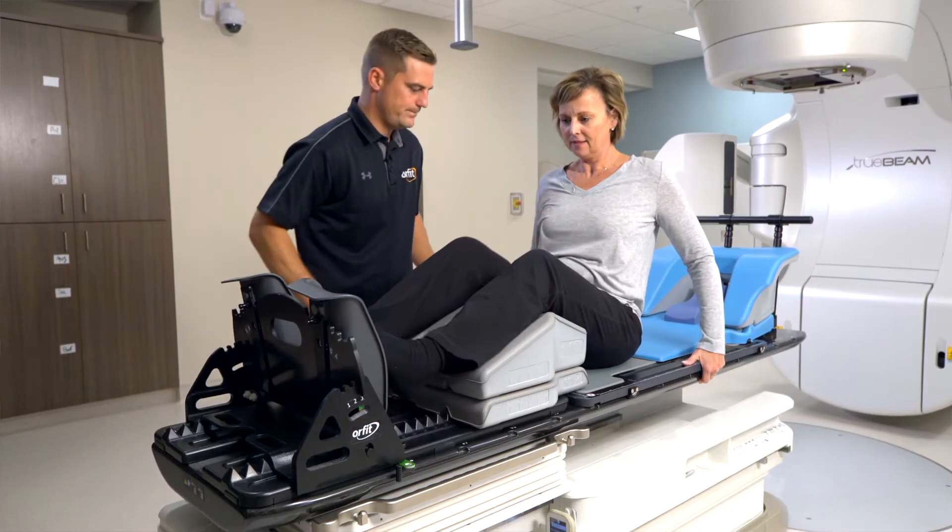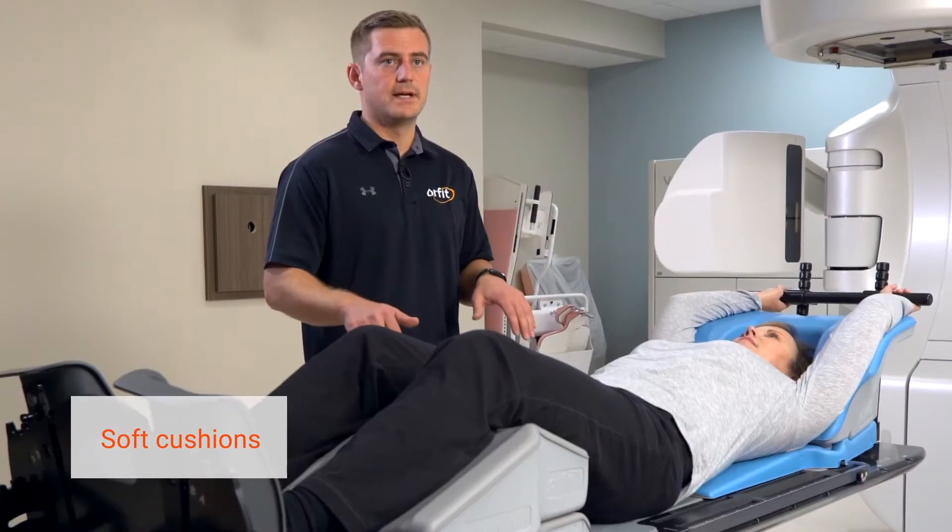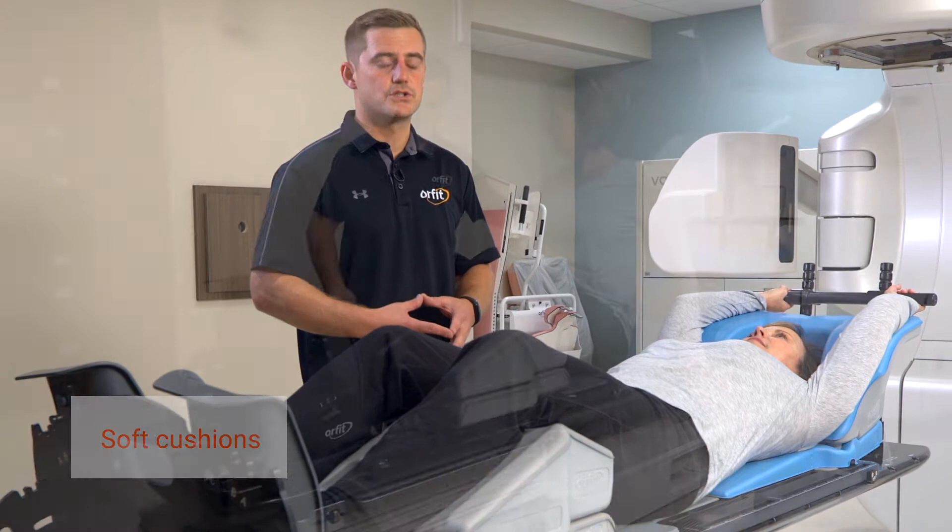Justin from Orfit here. Just want to point out some key features of the AIO 3.0. One of the main focuses here is patient comfort. We have an integrated cushion that's built into the base plate, so the patient is always laying on a cushion.